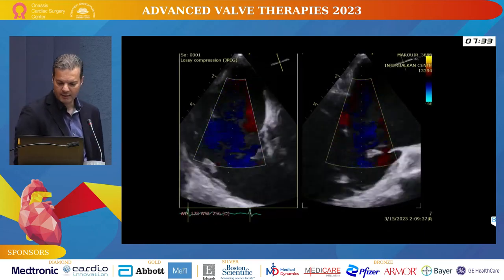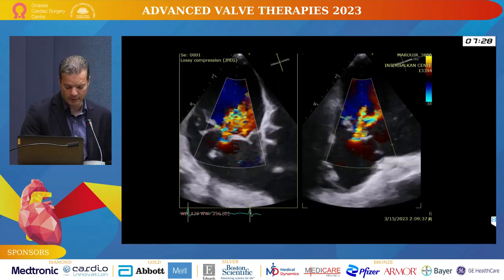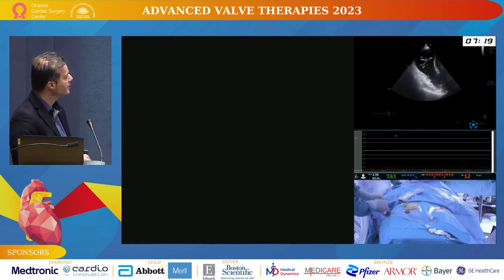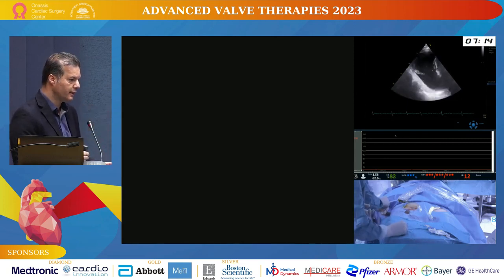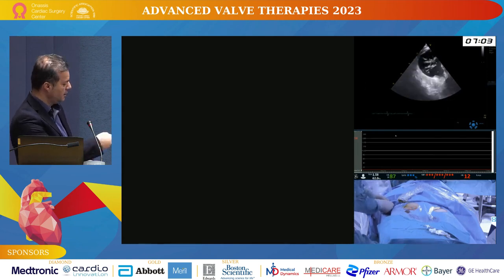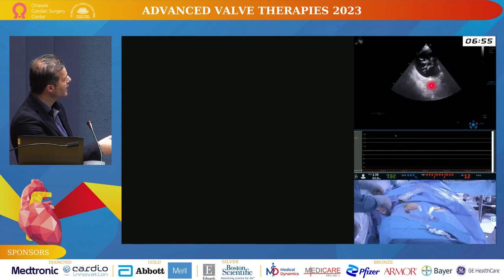Here is another view of that. You can see the length of the leaflets on the right side, quite long leaflets. The septal leaflet is almost 20 millimeters long. So following the conversation before, it's quite interesting that this is a valve that has some advantageous features for tricuspid clipping, like long leaflets, anteroseptal location, not a big gap, but it's a quadricuspid configuration. And you can see at the top right here, on the panel, the quadricuspid configuration; the images are even better during the case.